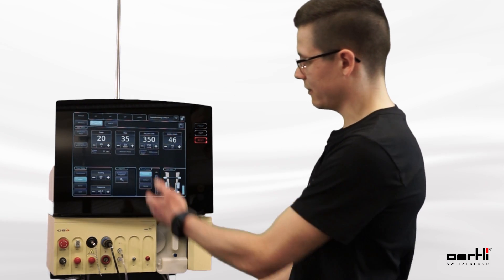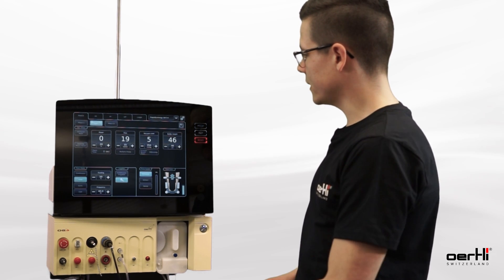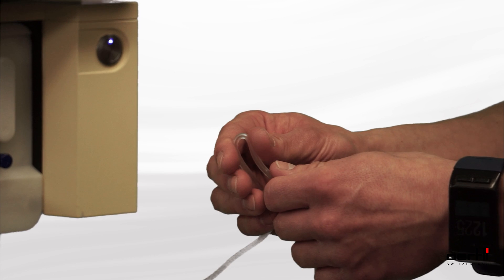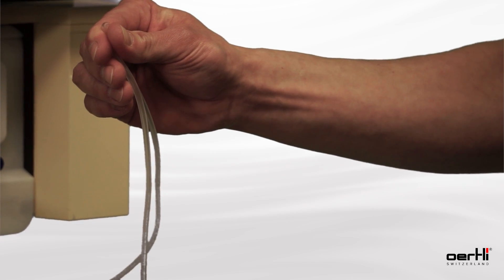If I now have it deactivated and step on the pedal, I irrigate and aspirate. Now I'm simulating an occlusion. You can see that all the main values apply and I can apply FACO power even if there won't be any occlusion — meaning if there won't be any lens fragment in front of the tip.